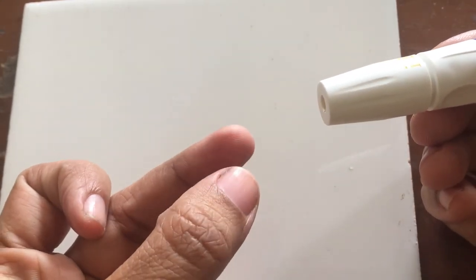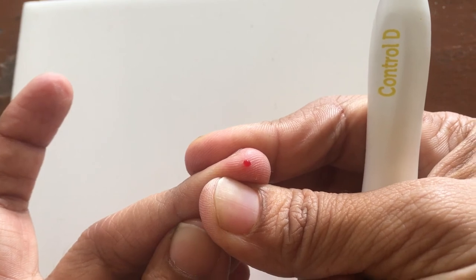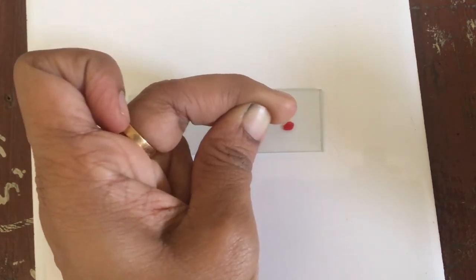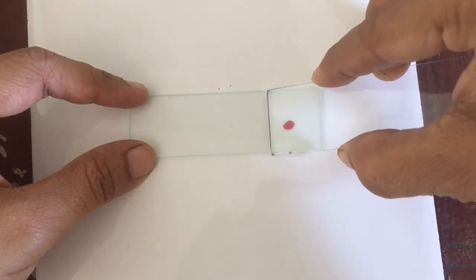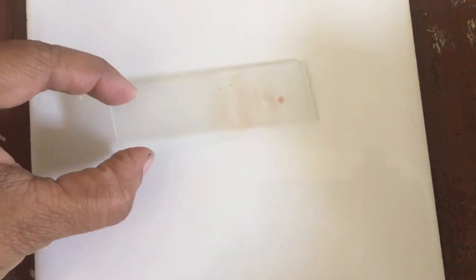The ideal site for pricking is the side of the finger, because that position will cause less pain. Do not squeeze blood out of the finger forcefully. After discarding the first drop, place the second drop at the right-hand end of the slide. Using a spreader slide held at a 40-degree angle, touch the margin of the drop to let it spread, then make a gentle swipe towards the front. A good smear looks like the shape of a tongue.